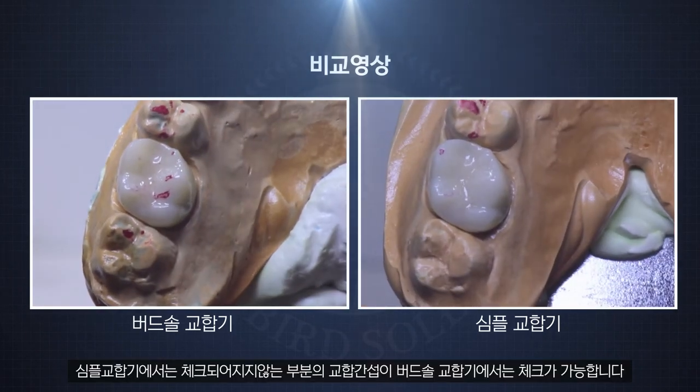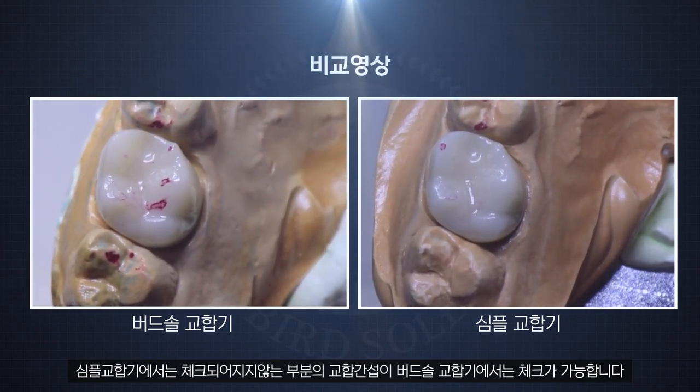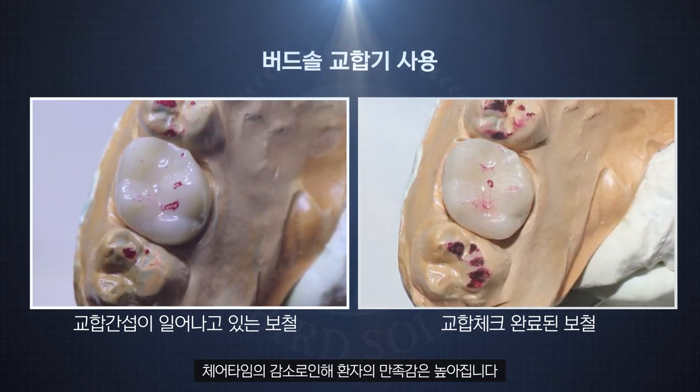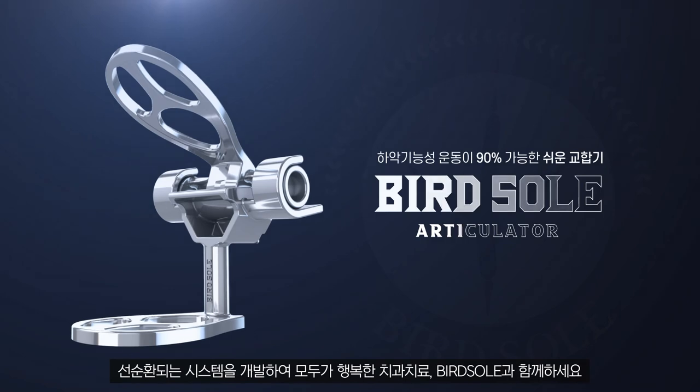BirdSole articulator can check occlusal interference that cannot be checked with a simple articulator. Patients also show higher satisfaction due to less chair time. The virtuous cycle system for the happiness of everyone — try BirdSole.